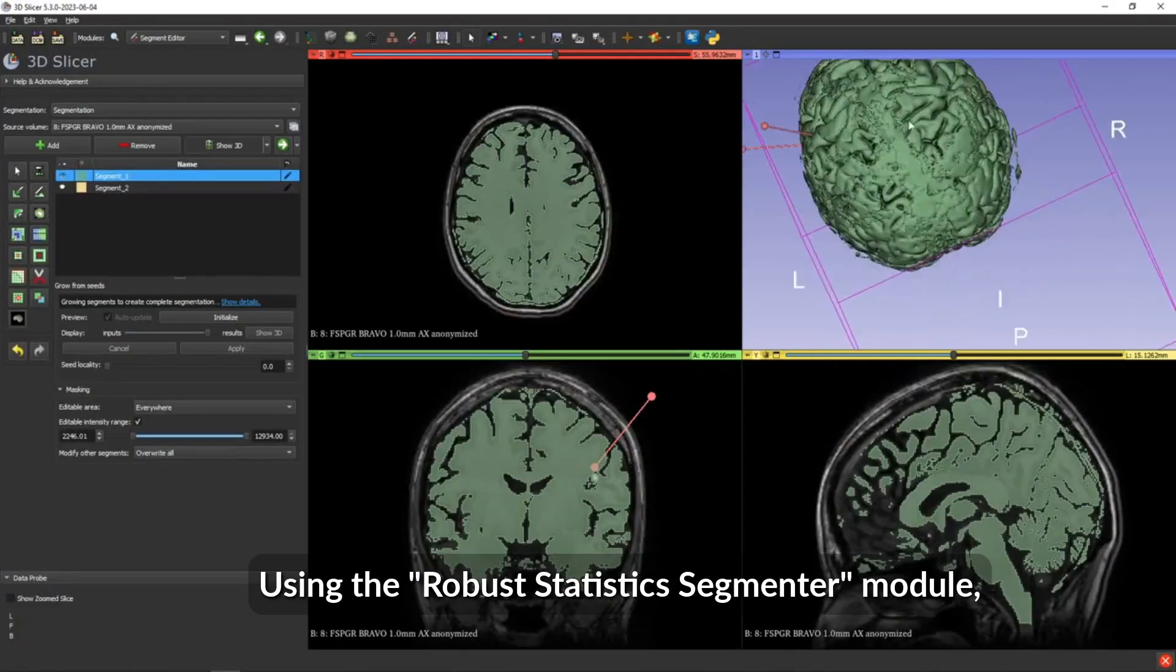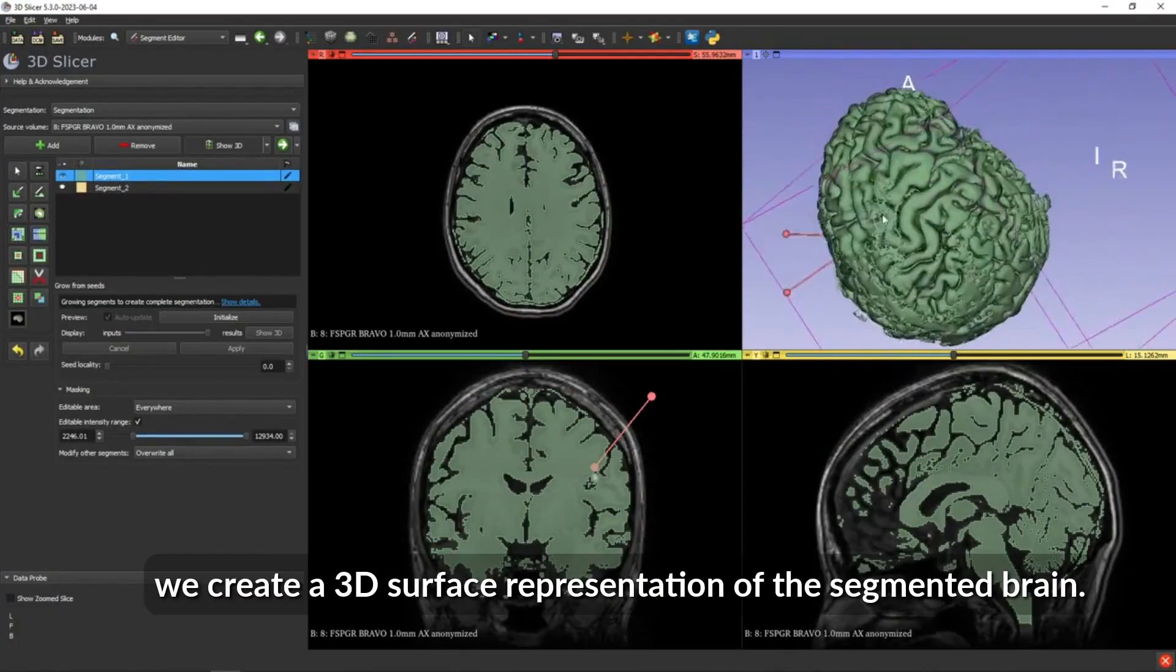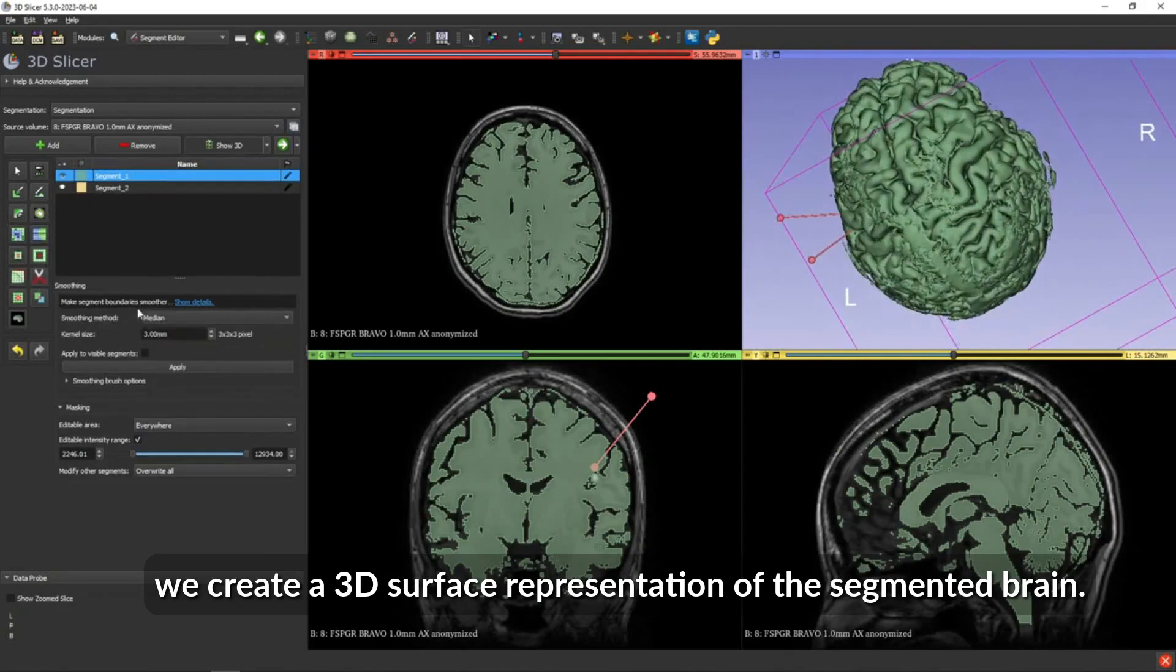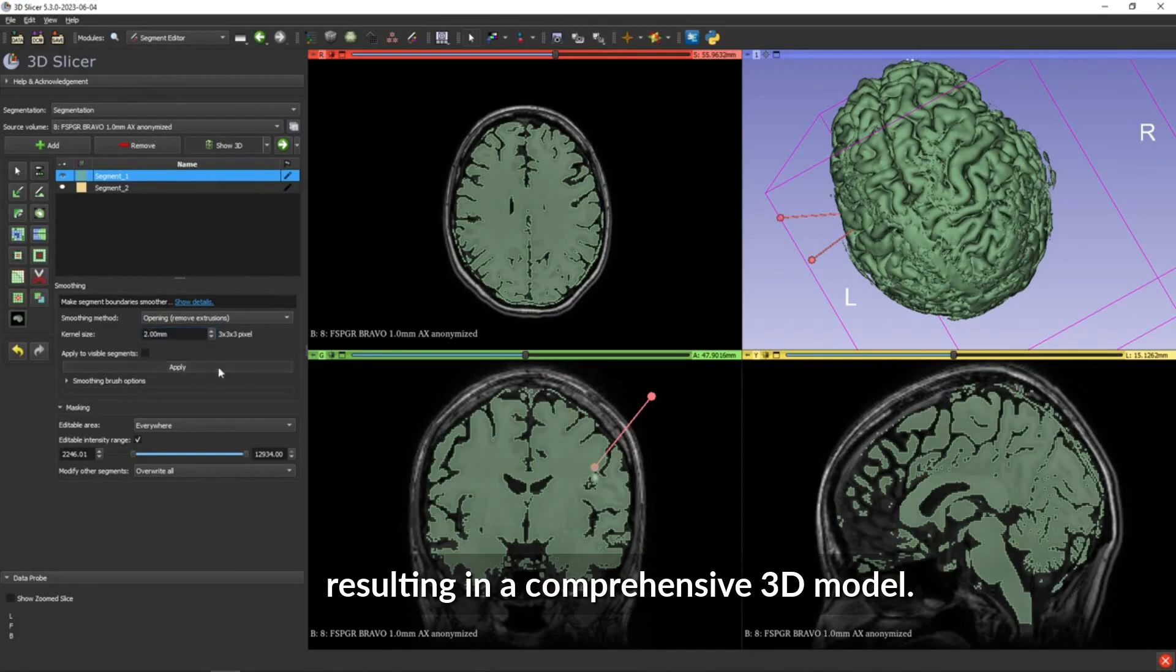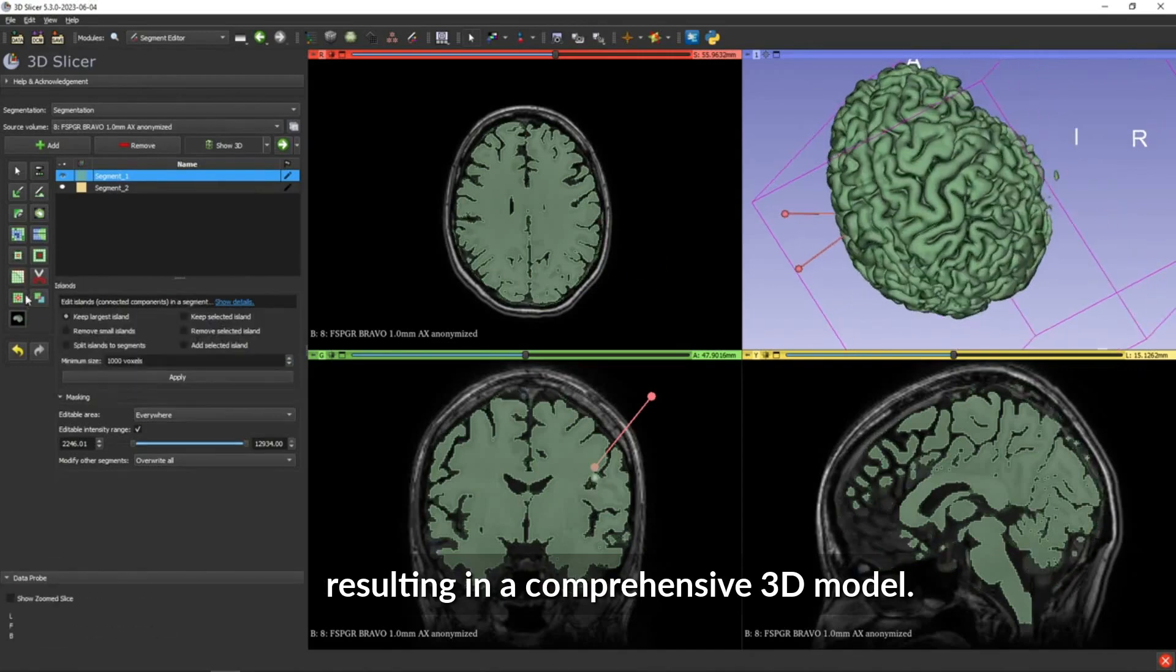Using the robust statistics segmenter model, we create a 3D surface representation of the segmented brain. This process extracts the boundary of the 3D object, resulting in a comprehensive 3D model.